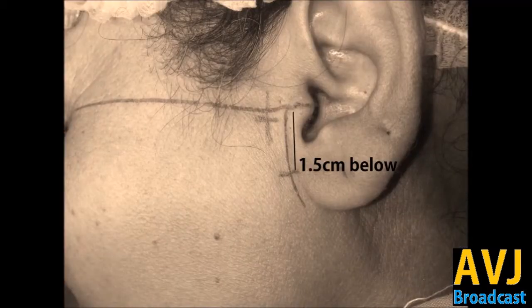In order to block the auriculotemporal nerve, go 0.5 centimeter ahead of the tragus and then 1.5 centimeters below. You will feel a depression — when the patient opens the mouth you will feel a depression, and this is the point where you have to hit the needle.